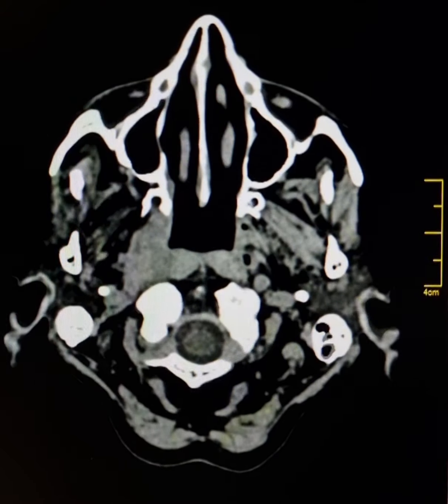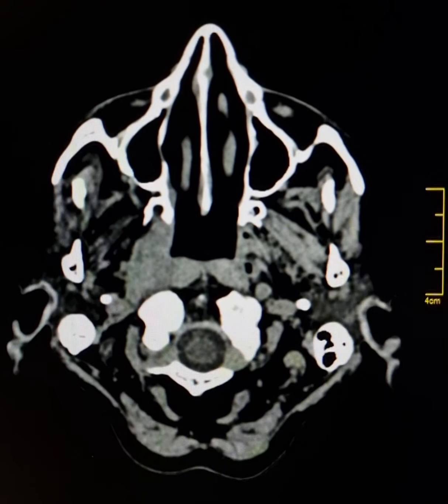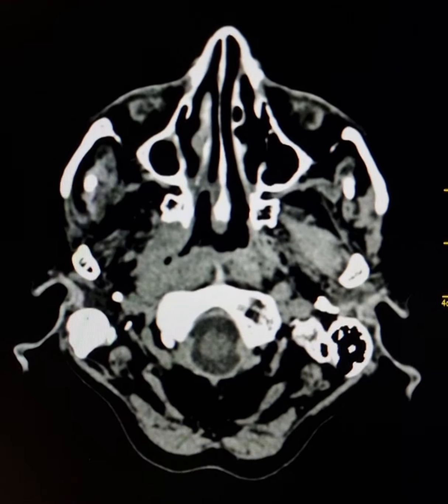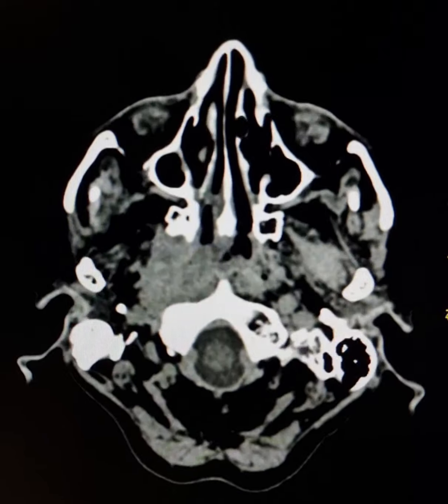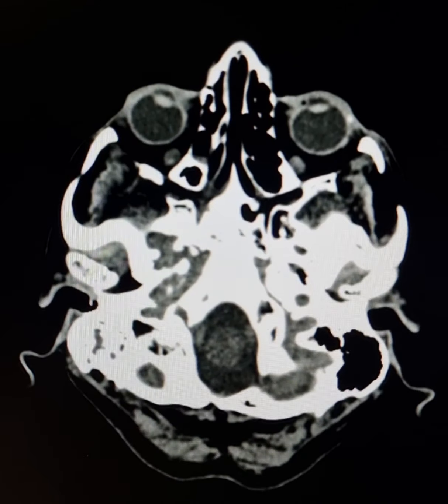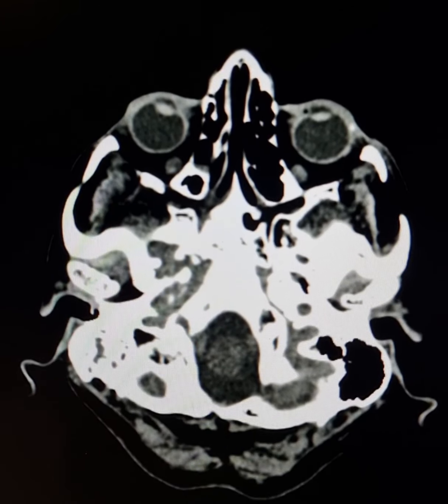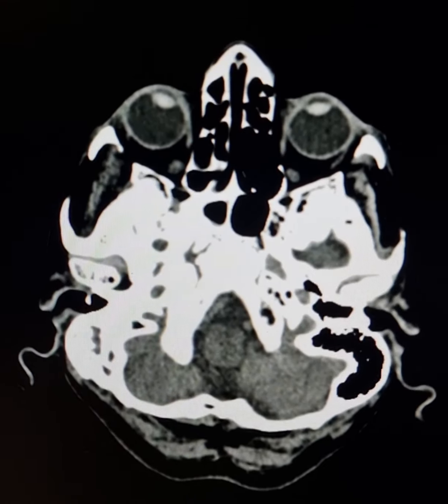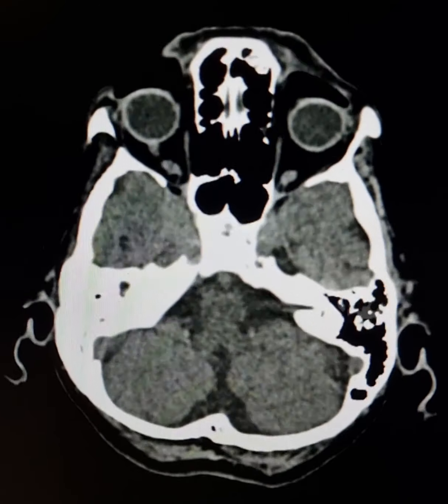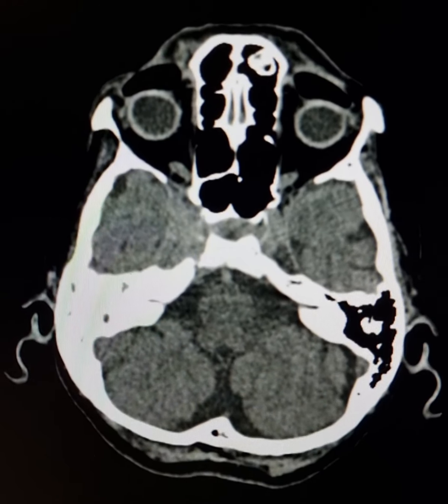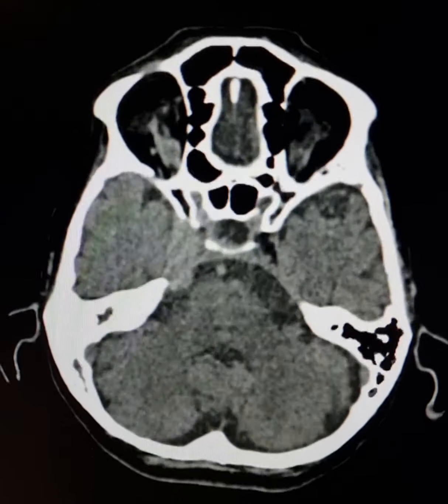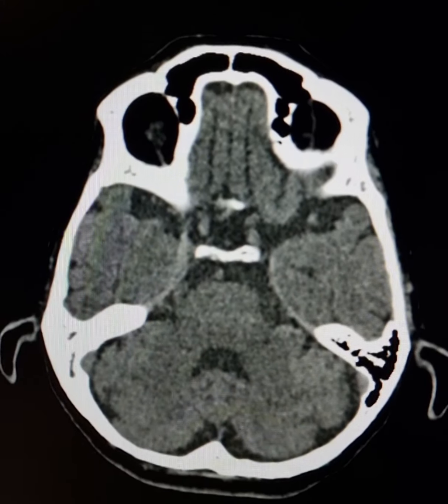This is a plain CT scan of a 72-year-old female who had multiple complaints including right-sided ptosis, diffuse pain along the right side of the head, and impaired hearing from the right ear.